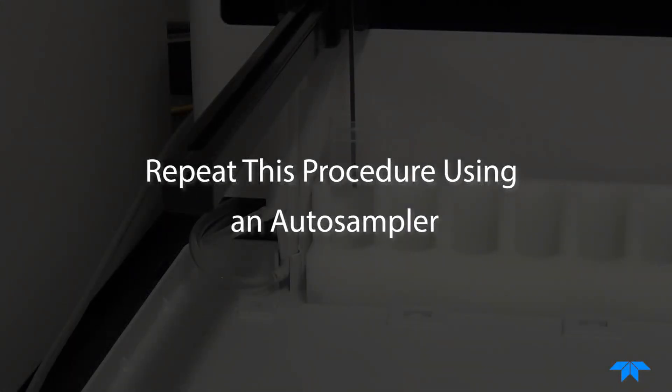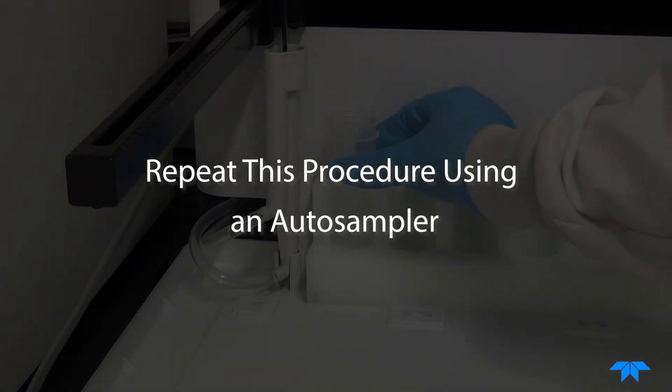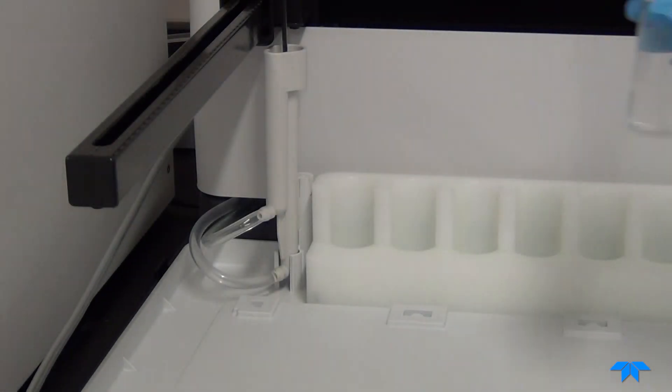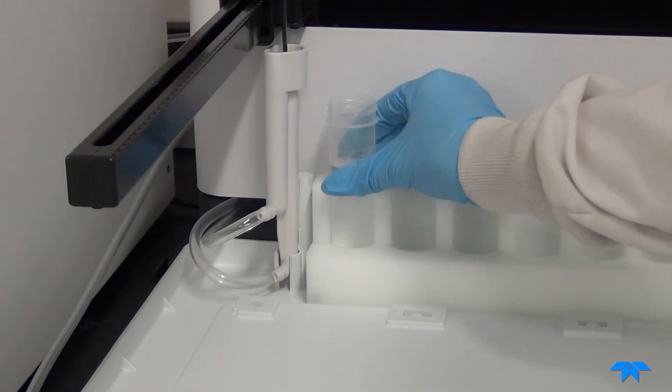Let's repeat this procedure for the sample probe to determine the sample and rinse flow rate. This can be done manually, but today we will demonstrate with the autosampler. Weigh the container with DI water to obtain a before weight, then place it into the autosampler.